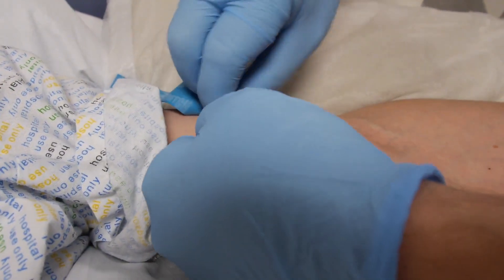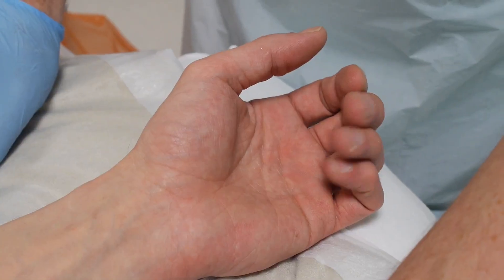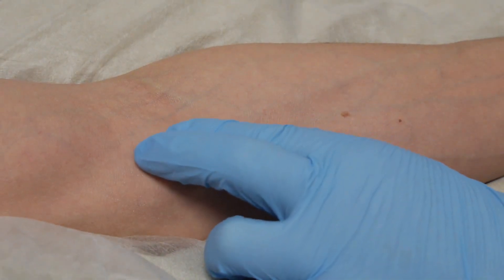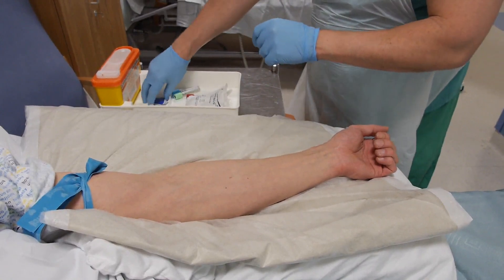If needed to encourage venous filling further, consider asking the patient to clench their hand. With the patient's arm in the down position, observe, select and palpate a suitable vein.